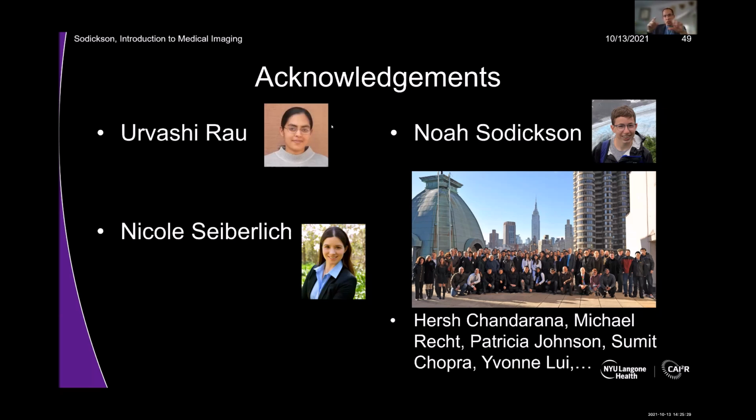So if the field is slightly different, experienced by some spin, just as Nicole said, it'll show up offset. And so, yes, we have to correct for that, but we also have some cool techniques to use that and basically get just a water image or just a fat image if we can manage it right.